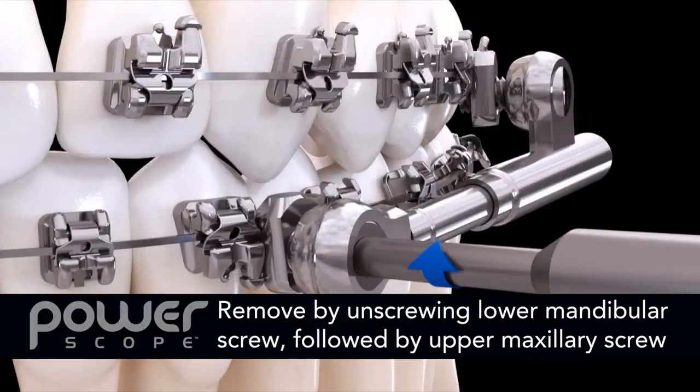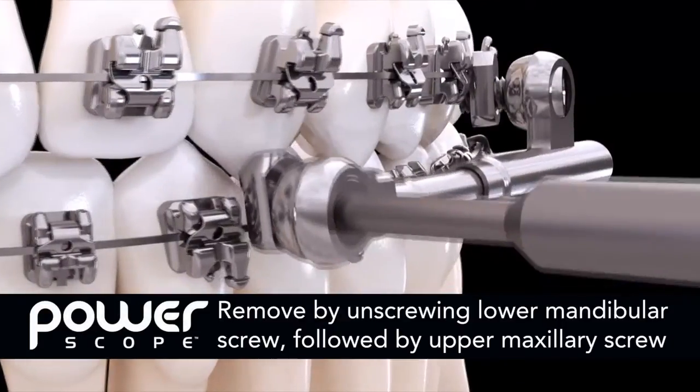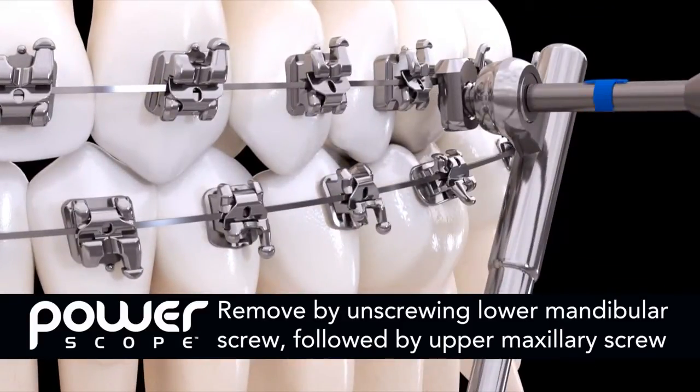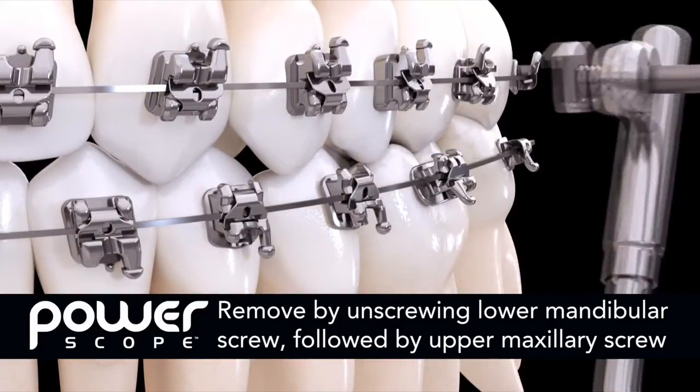To remove PowerScope, simply unscrew the lower mandibular screw until the nut assembly disengages from the wire. Repeat the process with the upper maxillary screw, then remove PowerScope from the patient's mouth.